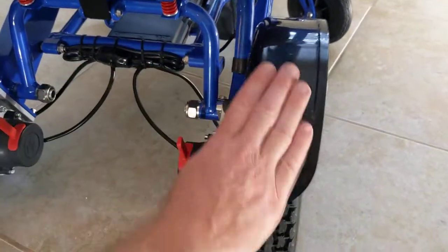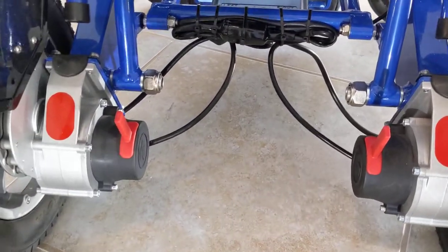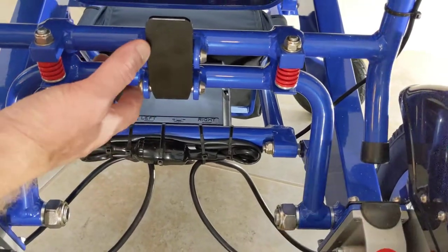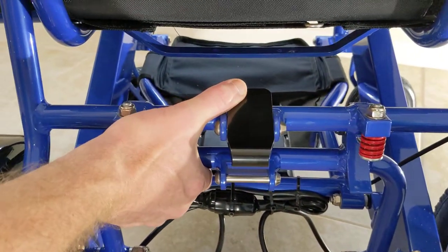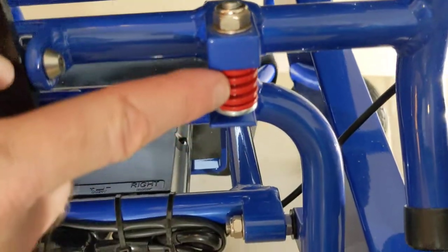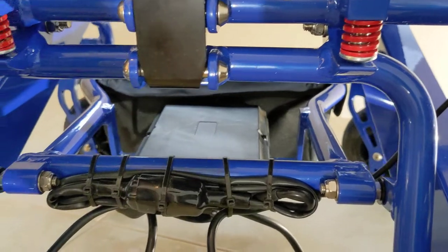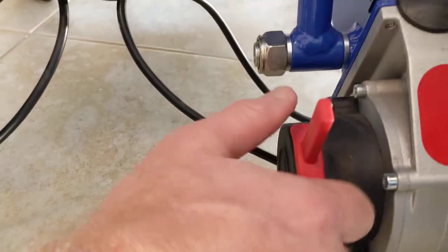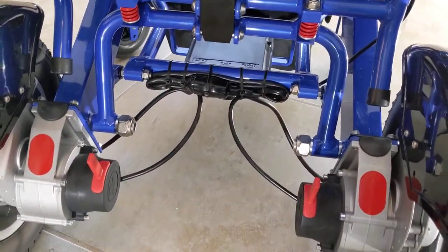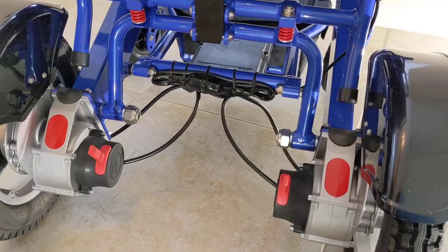Each hub has a 250-watt motor, one on the right and one on the left, with reflective material on the fenders. In the back of the chair is the latch that allows easy unlatching and folding, somewhat like a clamshell. There are also dura shocks designed to absorb energy from the ground. Latching mechanisms on either side let you switch between push-chair mode and power-chair mode.